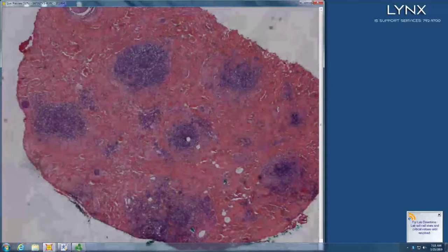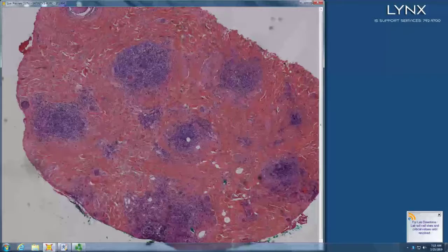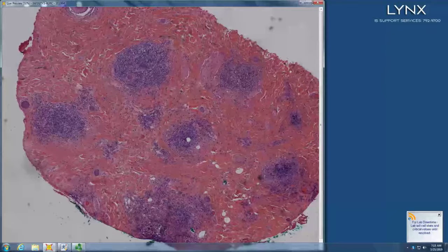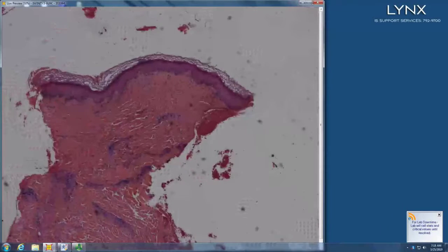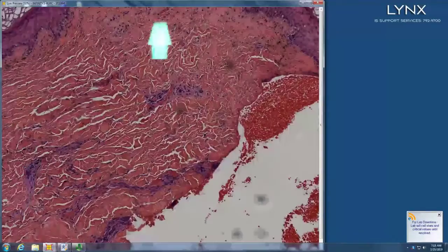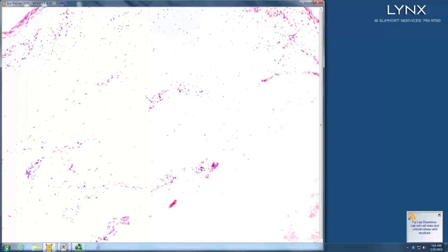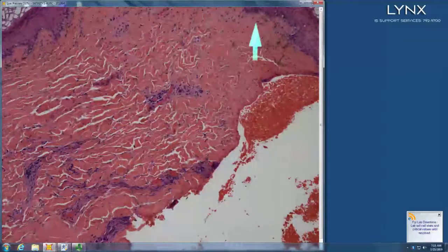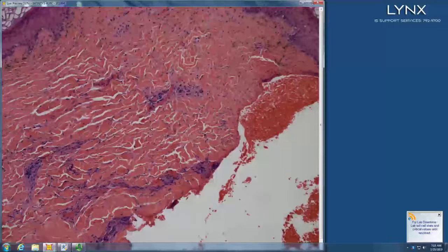In transverse section, when you're in the mid-dermis, those are big cannonballs of lymphs around the hair follicle, which would be vertical columns of lymphs in the mid-dermis in vertical section. And then you see the interface change. May or may not have basement membrane zone thickening, but certainly have pigment incontinence and vacuolar interface change. So, very good.